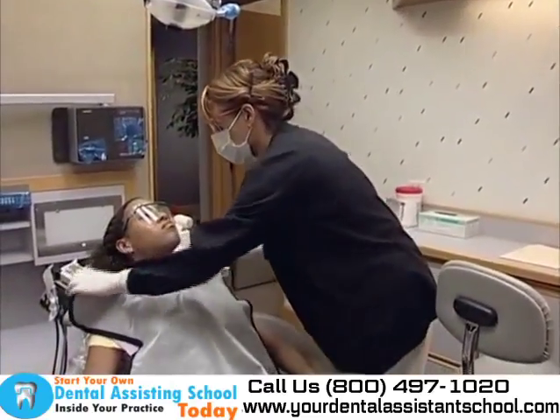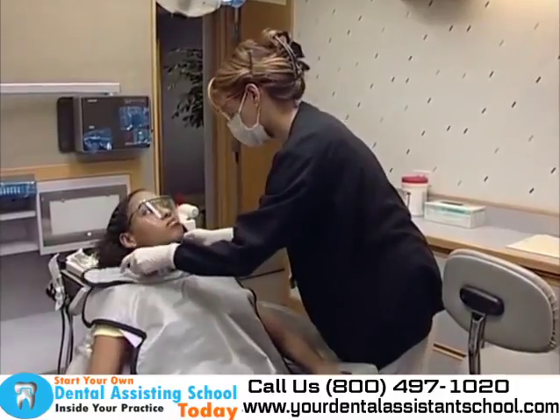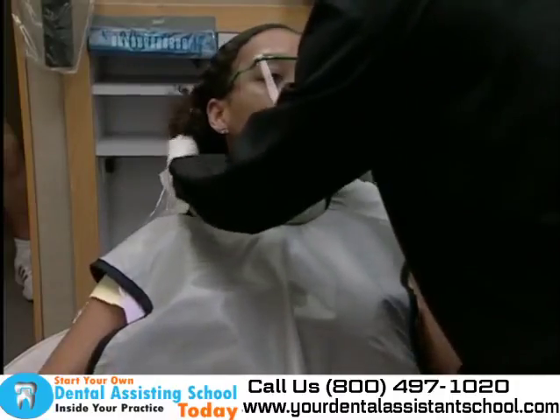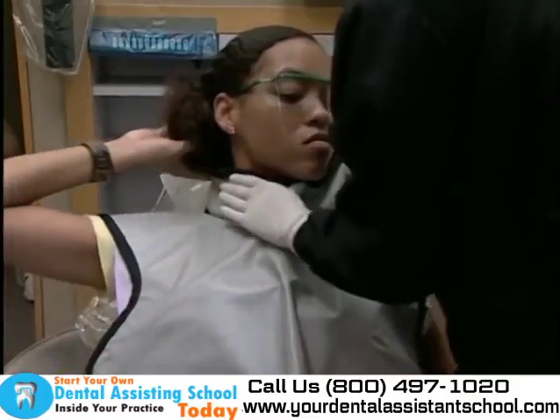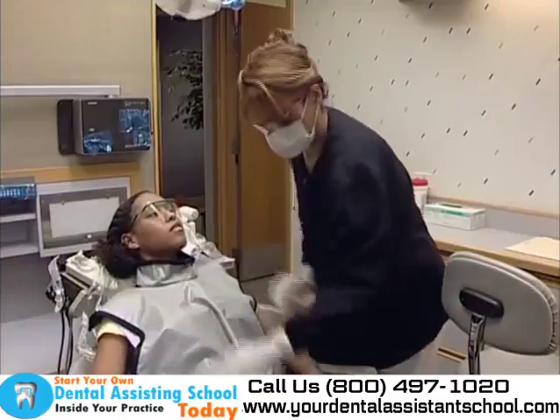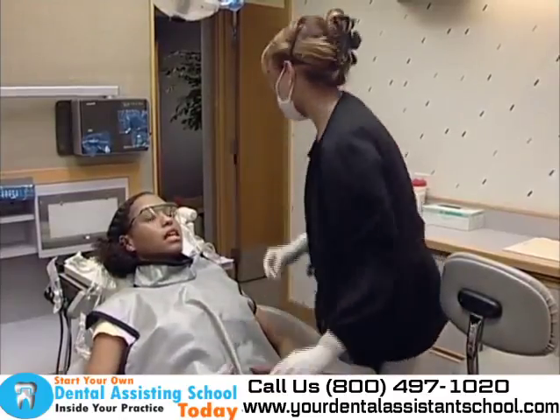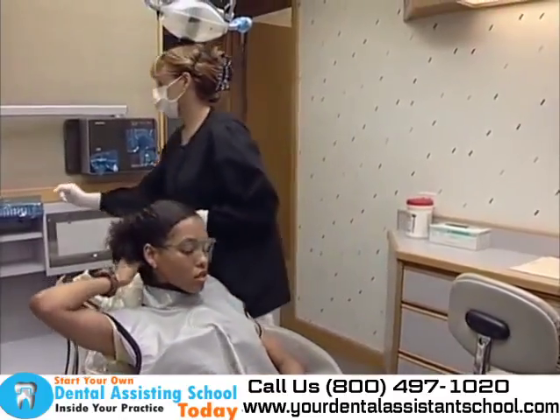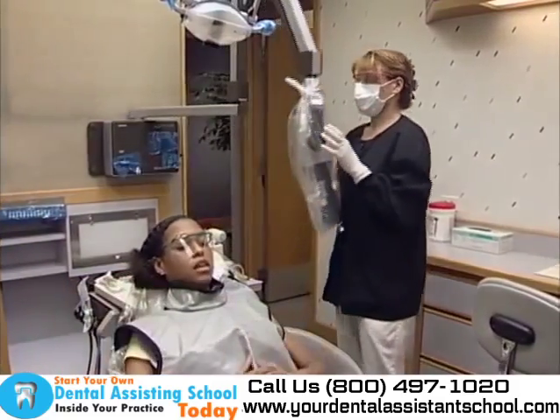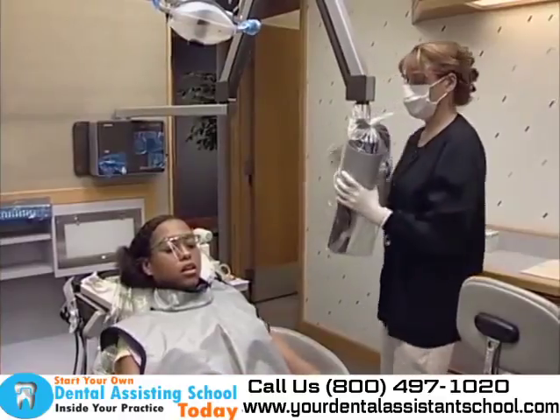Then the dental assistant places a lead apron and thyroid shield over the patient. The lead apron and thyroid shield aid in minimizing scatter radiation exposure to the patient's body. Faster speeds of film help reduce radiation to the patient because less exposure time is needed. The appropriate type of film is chosen based on the type of x-ray required.